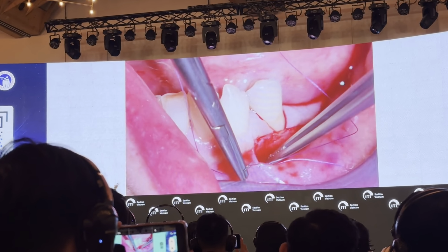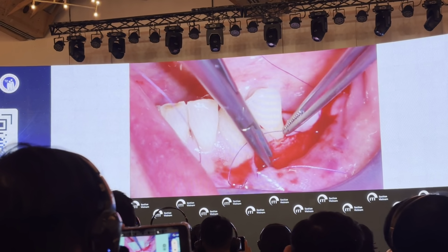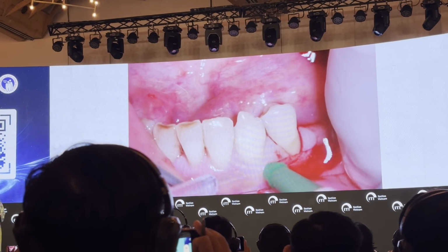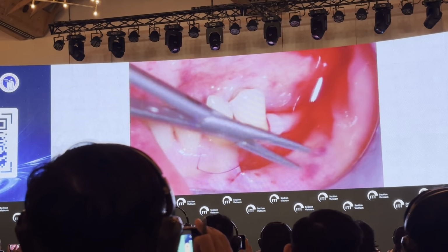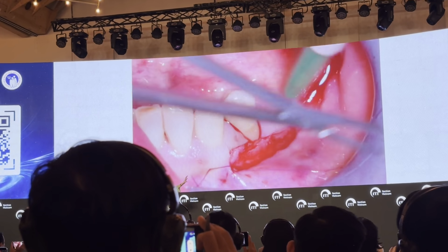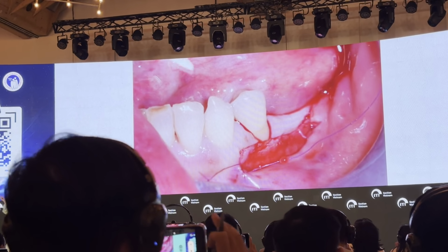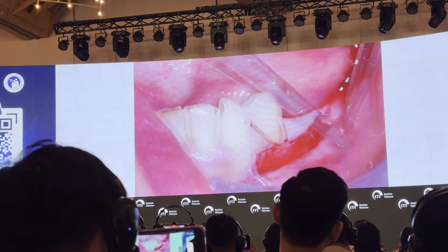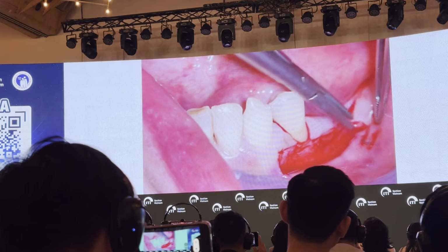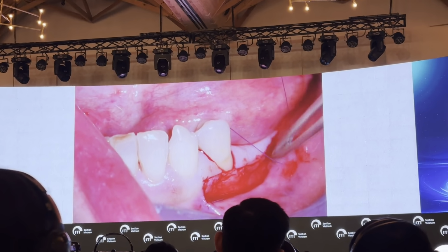So once my buccal flap made only of keratinized tissue is raised, I can fix it apically, performing the so-called vestibuloplasty, which consists of the apical fixation of the alveolar mucosa, maintaining my recipient bed free for receiving the free gingival graft from the harvesting procedure. So the alveolar mucosa is secured, anchoring the periosteum on the buccal aspect.